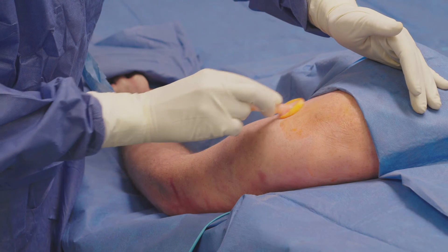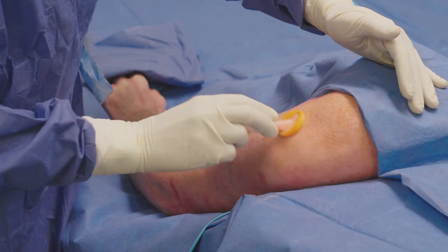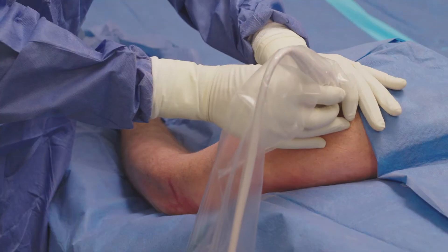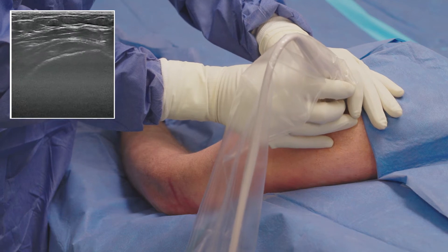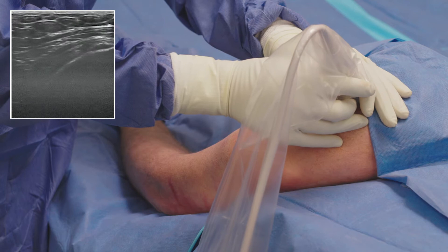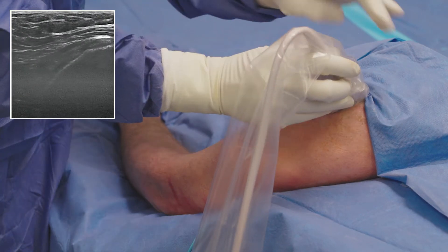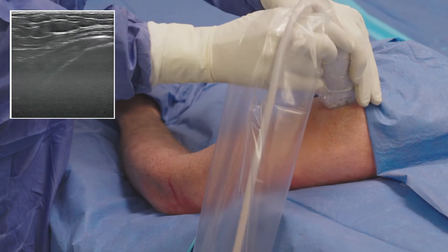Prior to the procedure, the patient is draped and prepped in a sterile fashion with the patient being placed in a beach chair position to access the shoulder. The procedure is performed under ultrasound guidance to visualize both the pathologic tissue as well as the positioning of the TenJet device. A layer of ultrasound gel is applied onto the probe cover as well as on the surgical site to increase the transmission of sound waves.